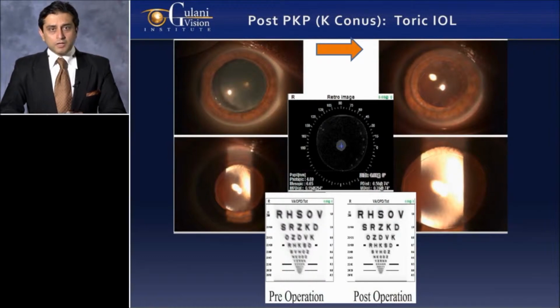For example, this patient was flown to me following a PKP long time done on this patient, beautifully done. The patient had cataract, high myopia, high astigmatism. Now, when I looked at this patient with the OPD, I could see the cornea had some impact on vision, meaning the cornea element has to be addressed. At the same time, the cataract was a major player in decreasing this patient's vision.